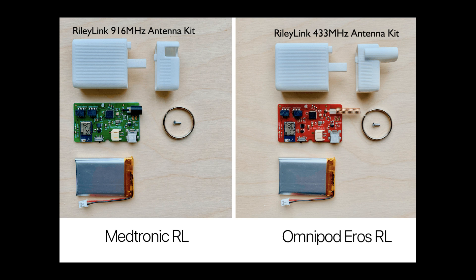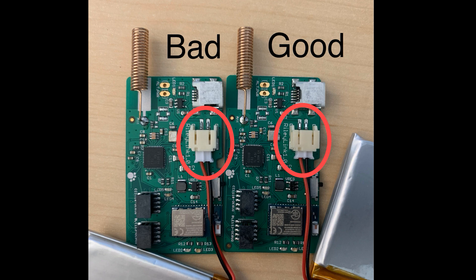Each kit comes unassembled, so you'll have to do some basic assembly like plugging in a battery, putting the RileyLink in the case, and putting in a case assembly screw. One important note about the assembly: the most critical part is to push that battery plug in as far as it will go. The battery plug is a tight fit, and many people stop short. Compare your RileyLink with the photo shown — if yours isn't pushed in as far as the good photo shows, keep going. Loose battery plugs will result in more frequent loops being dropped and pump communication problems.